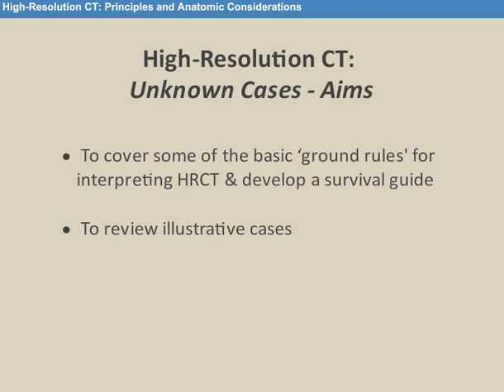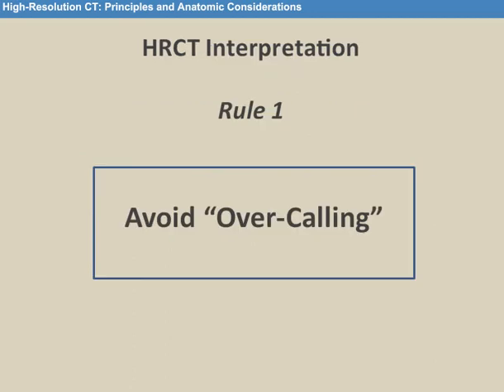Now, we may do that at a subconscious level, but it is a kind of useful survival guide, which I hope I can impart to you by the end of this lecture. And we'll do that by reviewing some illustrative cases. First and foremost, the most important rule: avoid overcalling.